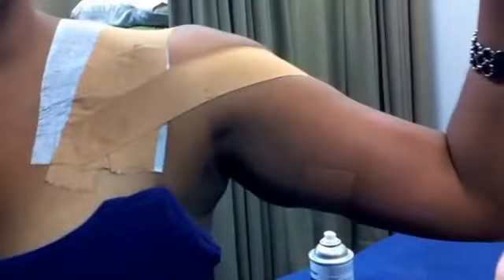Now wind the tape underneath the arm and around the anterior shoulder to meet the pectoral muscles. Be mindful of underarm hair as this can make the process rather unpleasant. Continue by applying a few more strips in a similar manner so as to cover the entire anterior capsule. The patient is to maintain position throughout this entire process.